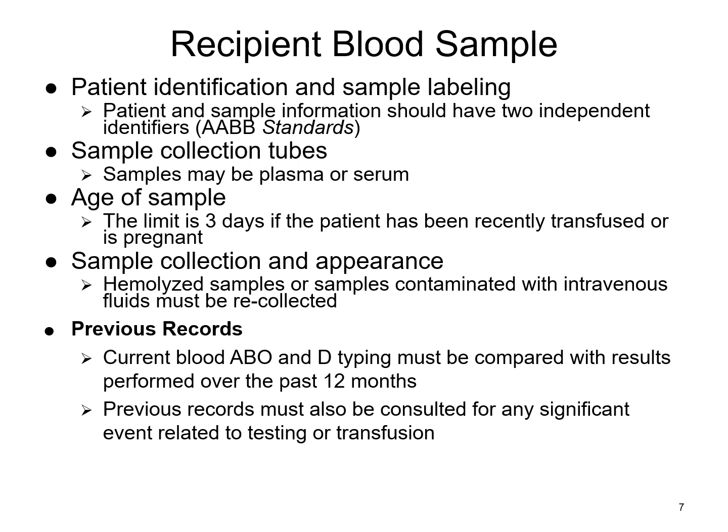It's not necessarily a rejection, so depending on your site, they may or may not get a clot recollected. Most places aren't, because if you're using serum, you're going to have that clot in there anyway. But just keep in mind, if the specimen clotted during collection, then sometimes you can see a little bit of fiber fragments, and that can sometimes give you a false impression that it's clumping when it's really fibrin.